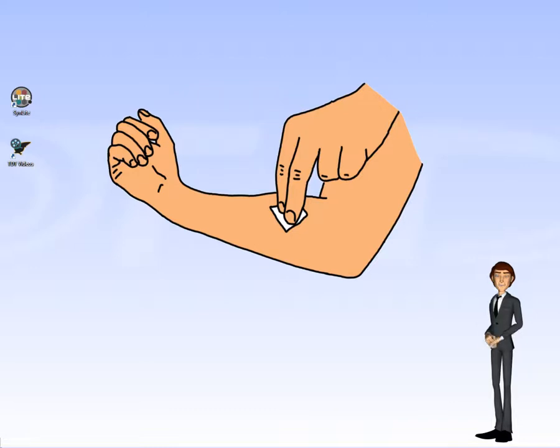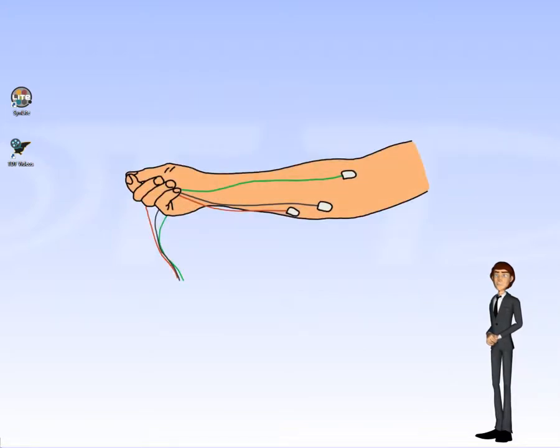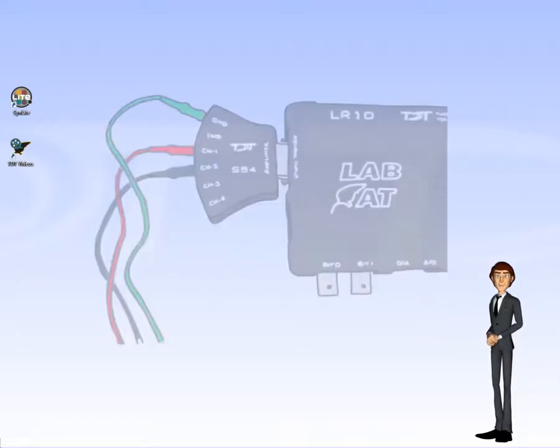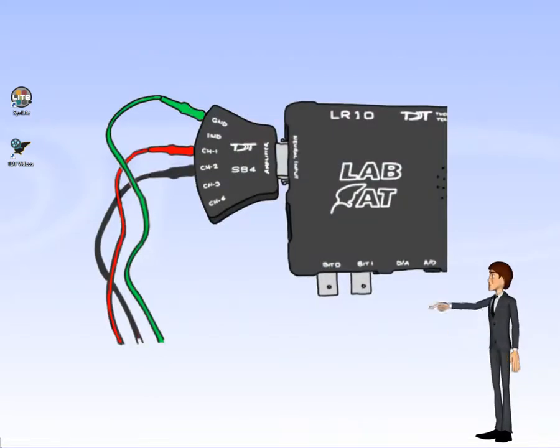Using the alcohol pad, scrub the skin aggressively where you intend to place the electrodes. Rub until the skin is red to remove oils and the dry top layer of skin. Now, stick the electrodes on like this. Red and black will be our signal and reference. The green is our ground. Connect the electrodes into the SB4 like this, and connect the SB4 to the LabRat's neural input.